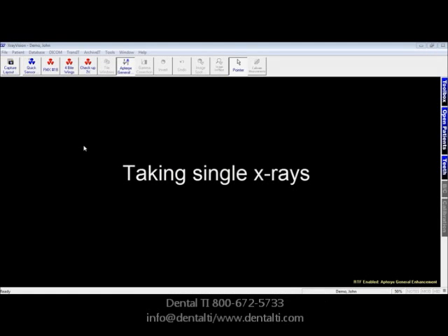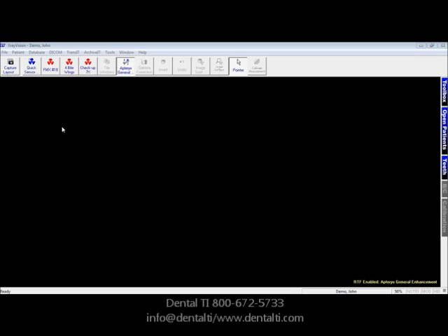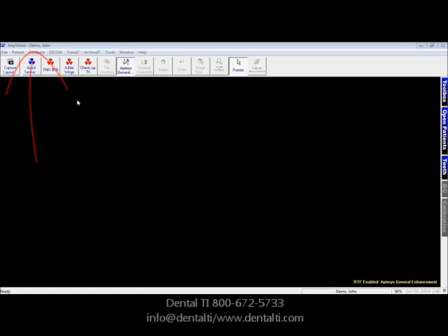Taking individual PAs in Dental TI's modified version of X-Ray Vision. First step: make sure that the patient is open that you want to take the X-ray on. Here you can see John Demo on the title bar — that's who we want to take the X-ray on. Second step: click on Quick Sensor.